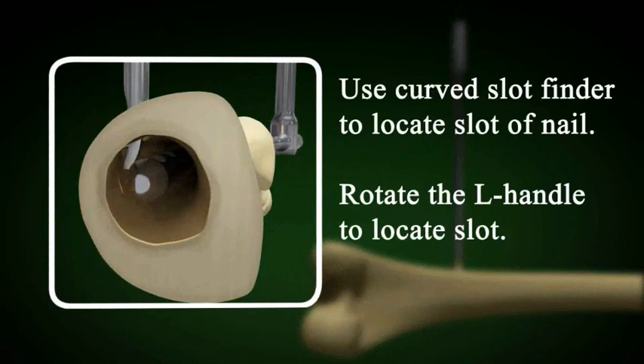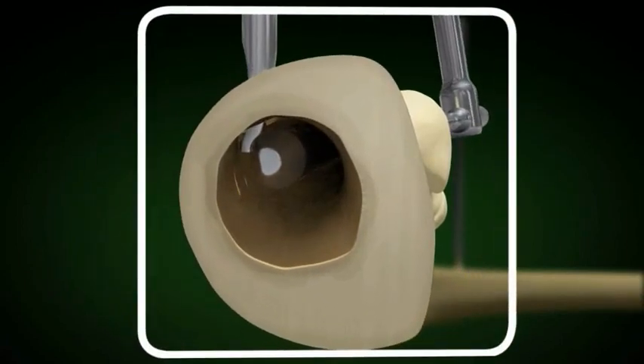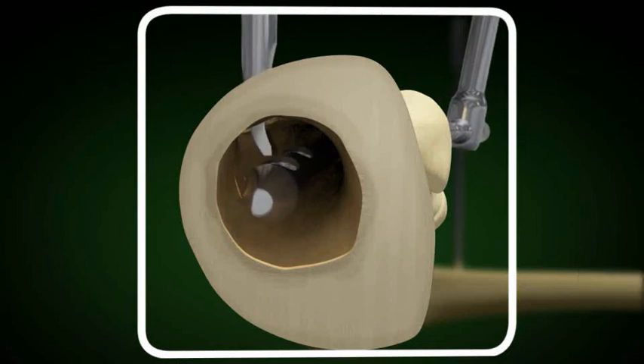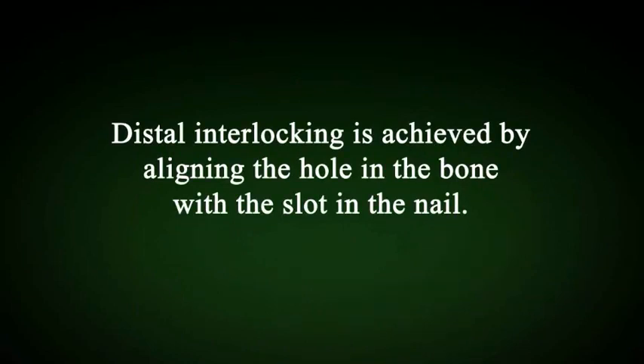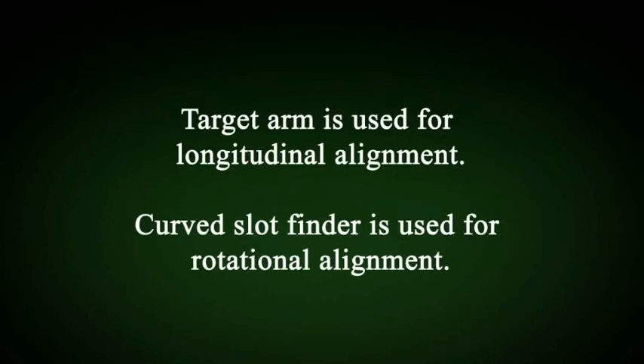The curved slot finder will be a very important tool for you. The curve can be adjusted 180 degrees to enter the slot in the nail. Rotation is very important when using the curved slot finder — the surgeon should have his hand on both the L handle and the curved slot finder. Distal interlocking is achieved by aligning the hole in the bone with the slot in the nail. The target arm is used for longitudinal alignment and the curved slot finder for rotational alignment.